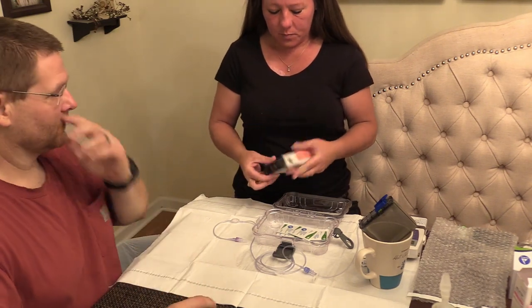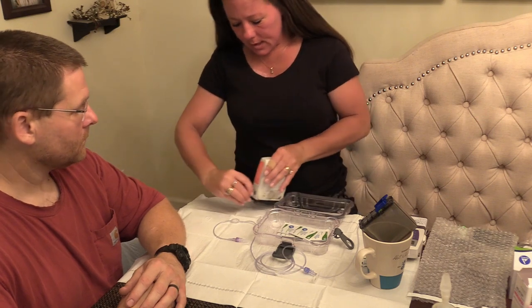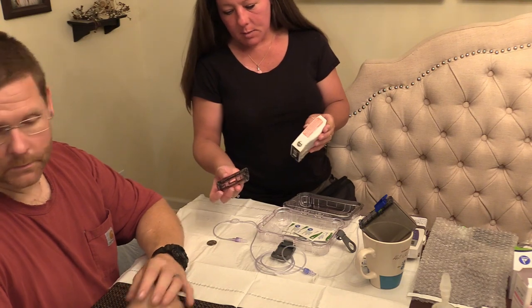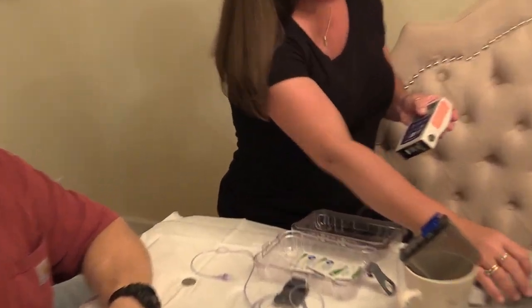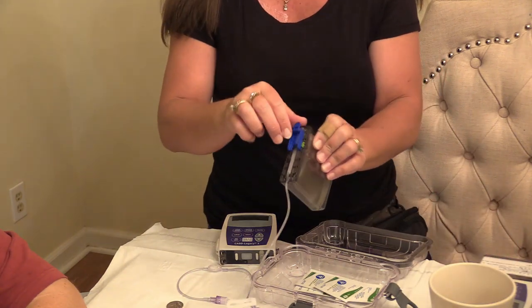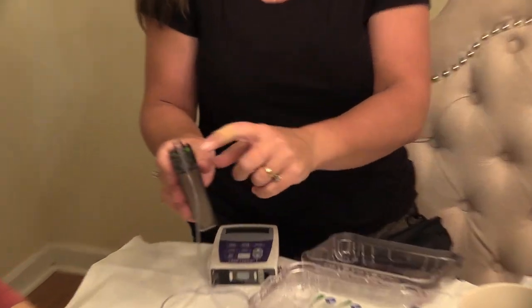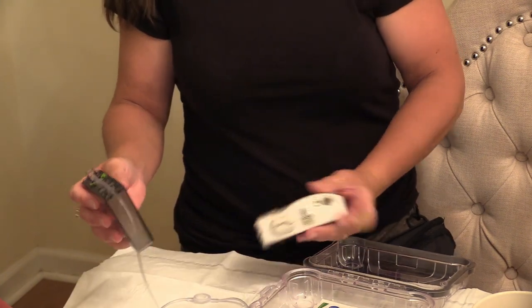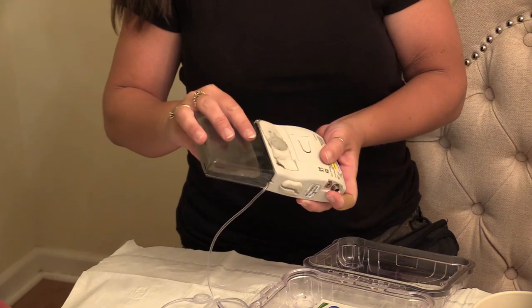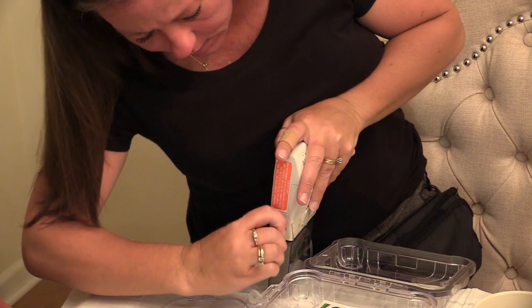You can use a coin — a nickel — to twist this and open it. This comes off, then you can take the blue cap off. These are the feet and it hooks in here, and you can push down and lock it.